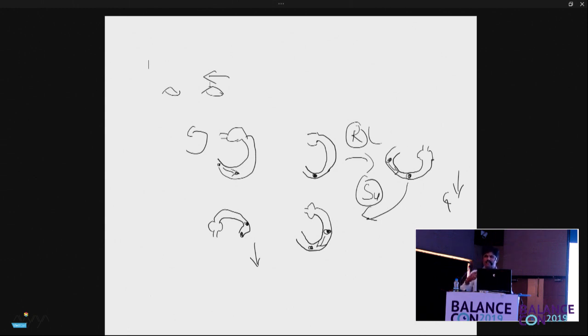So we first started off with alphabets, then we made some words, then using those words, some conclusions. Then the next thing is actually sentences. When we look at videonystagmography, we see something called saccadic pursuit, and then we want to see what the causes of saccadic pursuit are. We get some 30 causes and we are lost. We see something like hypometria in saccades, and when we look up the book, it is seen in some 20-30 cases, and we are lost as to where exactly the problem is.